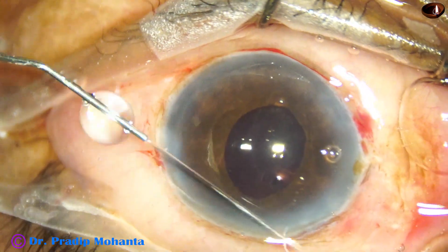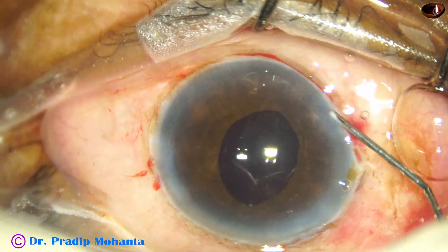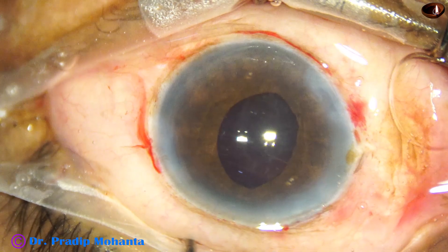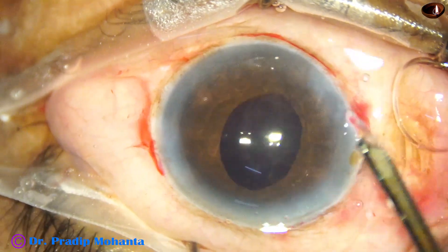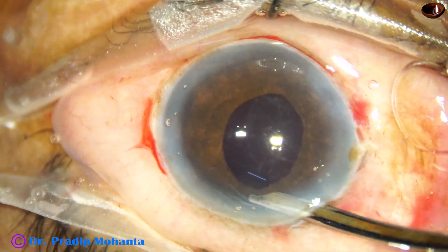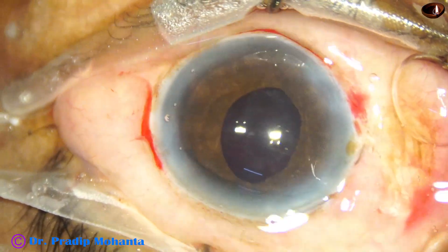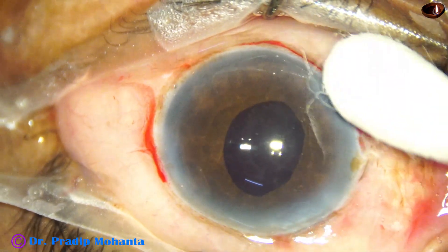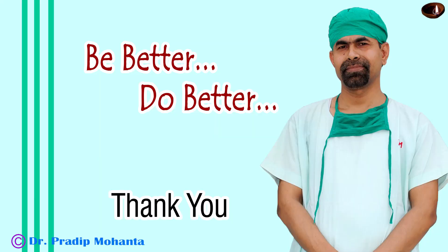The side port is closed by corneal stromal hydration. Now we are going to close the case — before that, this is a final lavage of the anterior chamber. The anterior chamber is nicely formed and the case is concluded. Thank you very much for your attention; hope this video will help you in developing your surgical skills. Be a great surgeon and serve your patients with love, respect, compassion, and great surgical competence.